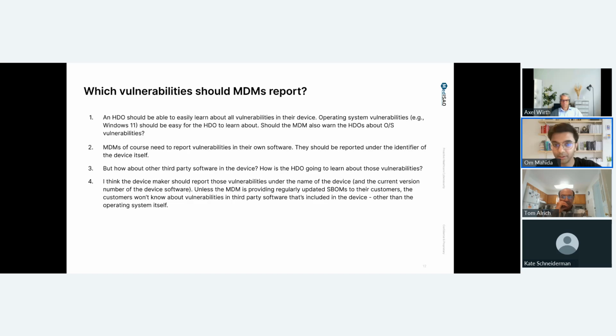And so it's important when we're thinking about how a device manufacturer in the medical space needs to report vulnerabilities, I think it's useful to use that analogy and follow a similar paradigm, where a device manufacturer is reporting vulnerabilities for the whole device and the release version, because that's what the end user, the hospital or clinic, knows, and is servicing vulnerabilities and patches for everything from application software they've written to the operating system and firmware, as long as they are shipping that device to a hospital.